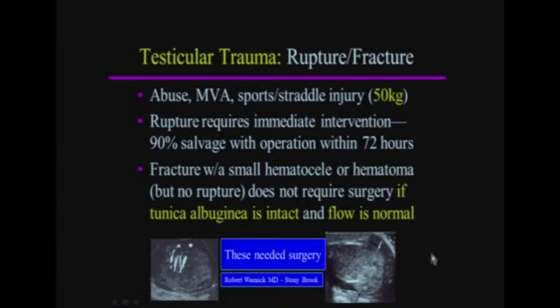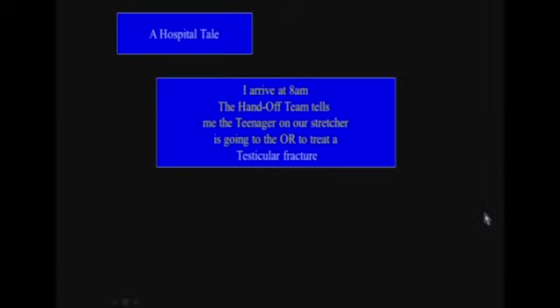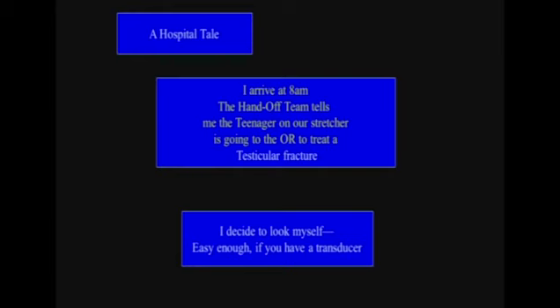There's a step off, and that's an indicator of a fracture of the tunica albuginea. So, another case, a hospital tale. I have arrived at 8 a.m. The handoff team tells me the teenager on our stretcher is going to the OR to treat a testicular fracture. I decide to look for myself.